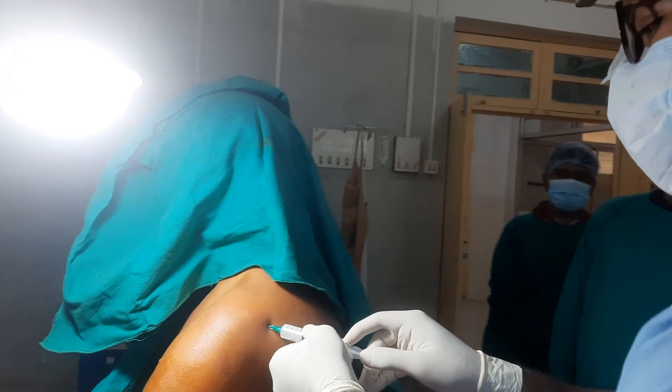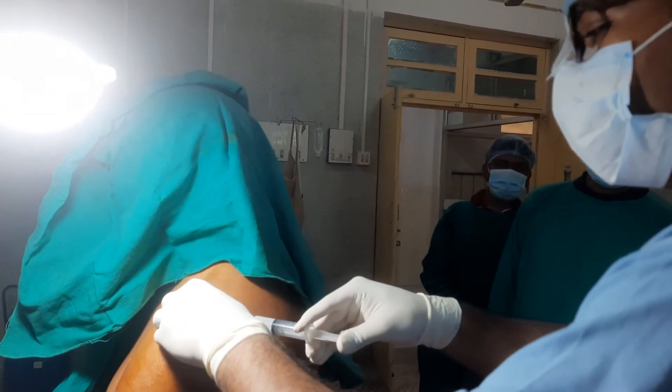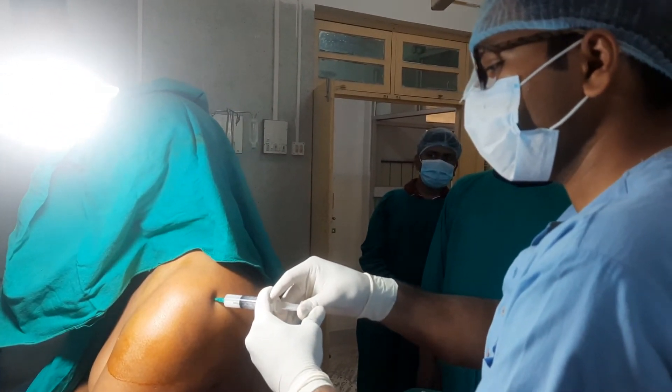As per the rule of any injection procedure, first I have to aspirate just to confirm it has not entered inside any blood vessel.